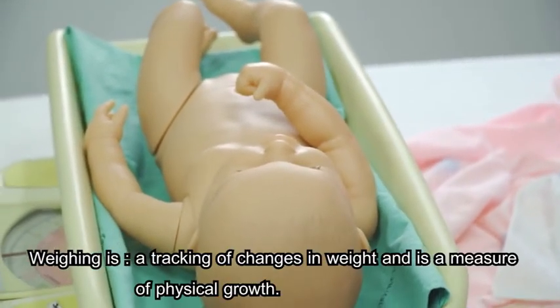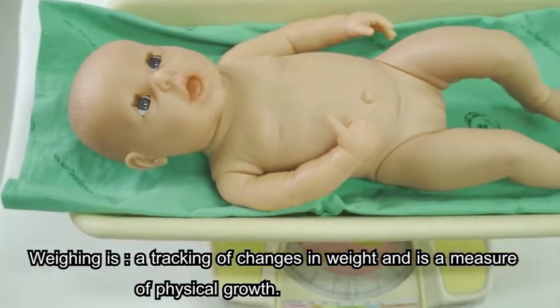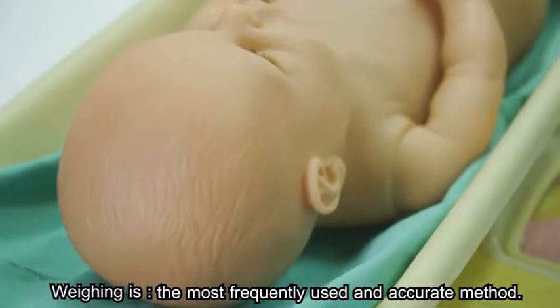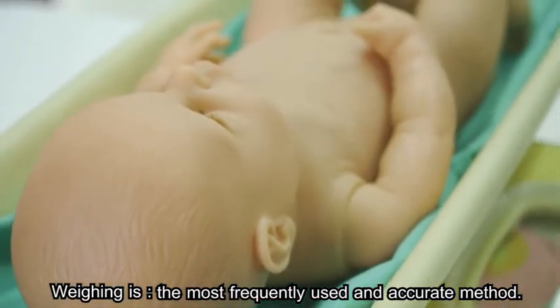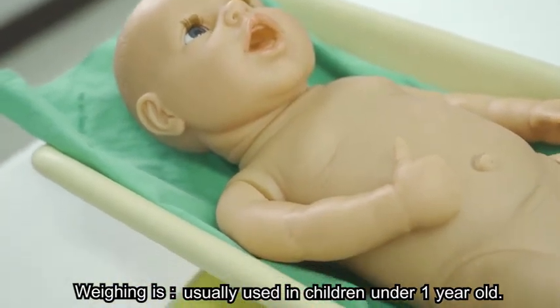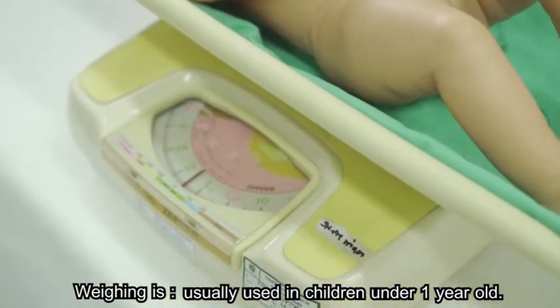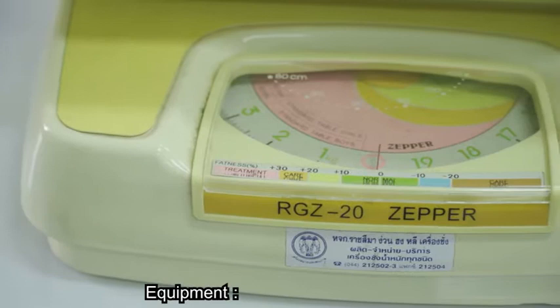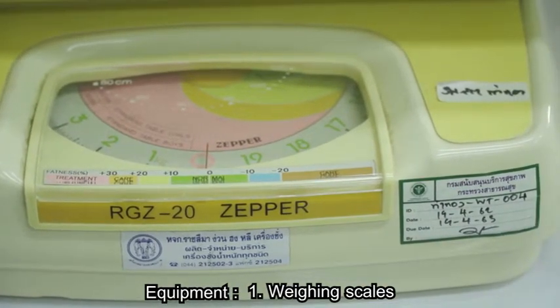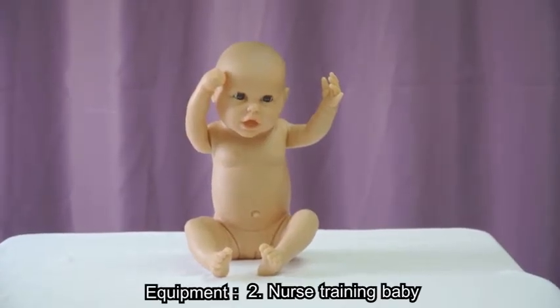Weighing is a tracking of changes in weight and is a measure of physical growth. Weighing is the most frequently used and accurate method, and weighing is usually used in children under 1 year old. Equipment: 1. Weighing scales, and 2. Nurse training baby.